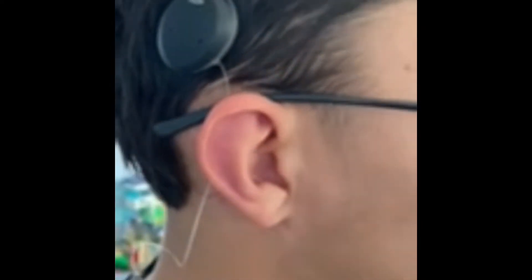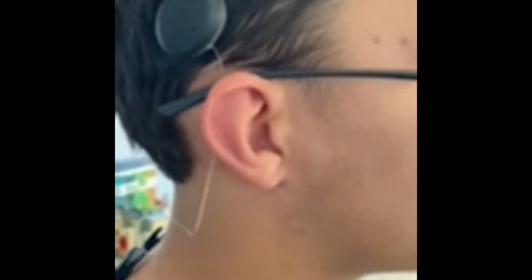The Osia is a bone-anchored hearing aid that goes under the skin, so you can't see it. It doesn't cause any infections and it uses a magnet that goes under the skin.